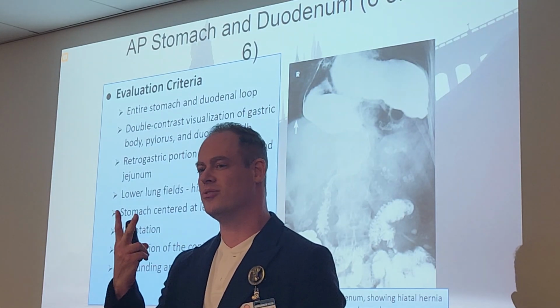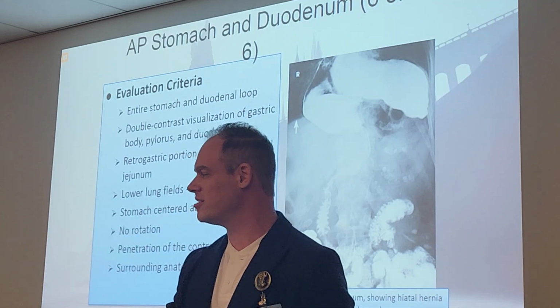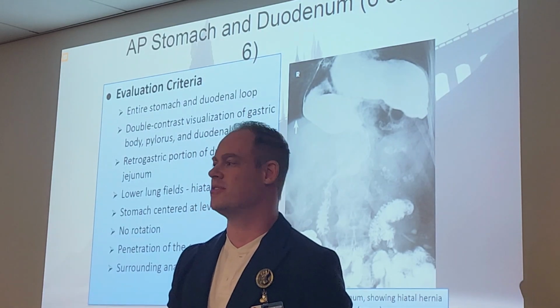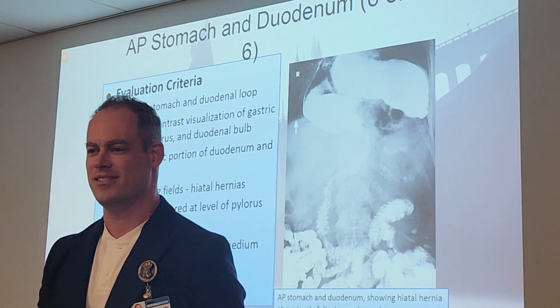Really, since you just need to learn 2, you know all the rest. LPO and supine. Those are both barium in the fundus, air in the body. All the other ones are opposite.